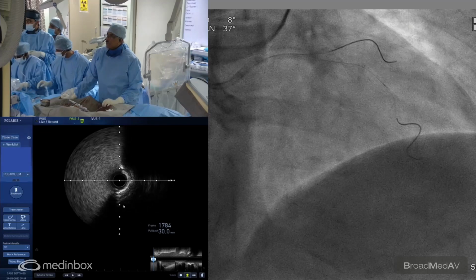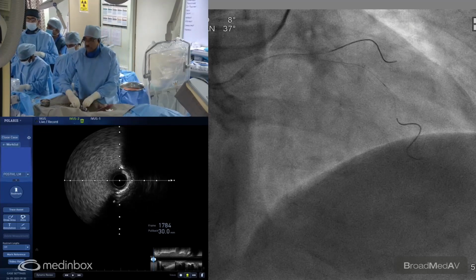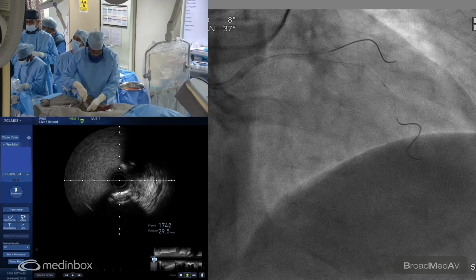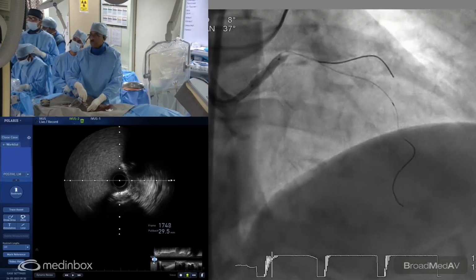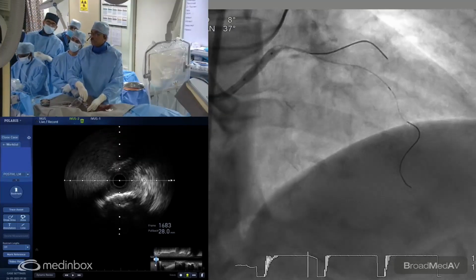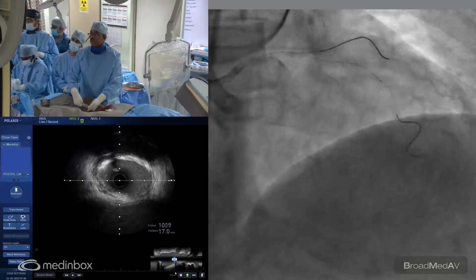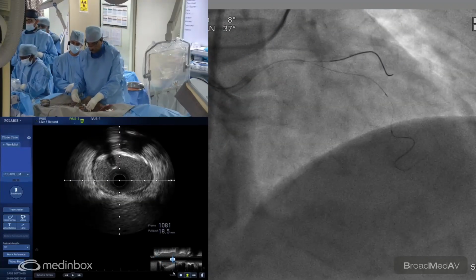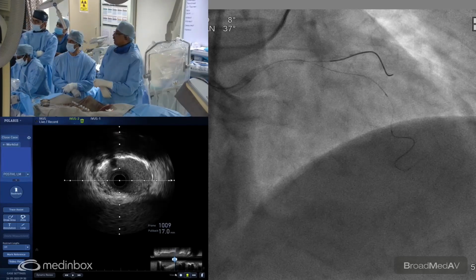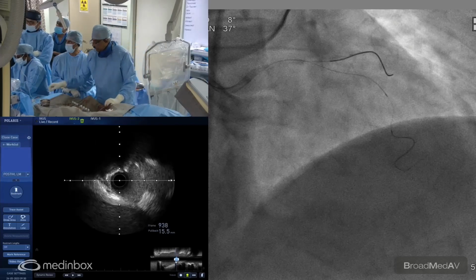It's just to spongify the calcium and to expand the stent in a better way. And fluoroscopically, we have seen clear expansion of the IVL balloon. Okay, can you show the fluoroscopy again to show the expansion of the balloon? Yeah, so you can see that it's pretty much open at 3.5. So I think basically we have prepared the artery well enough. And now deciding the stent, I think no further predilatation is required.